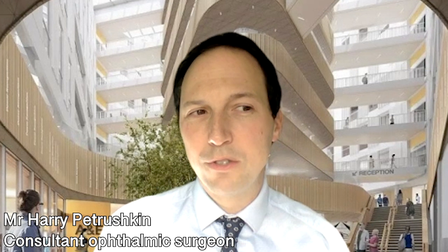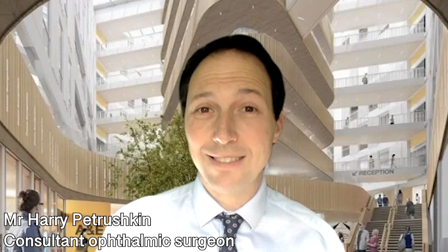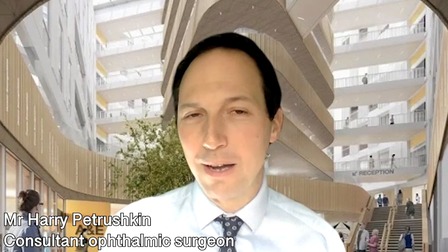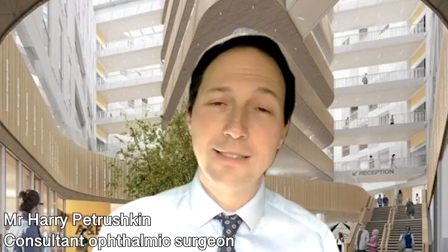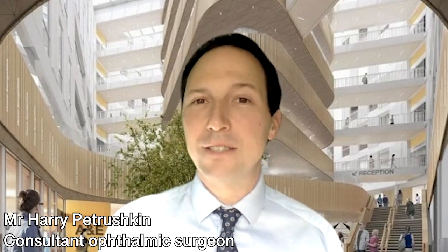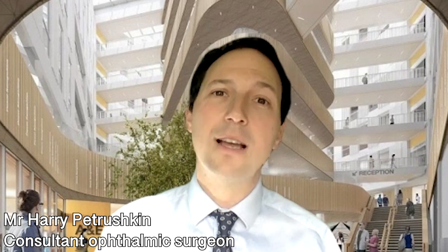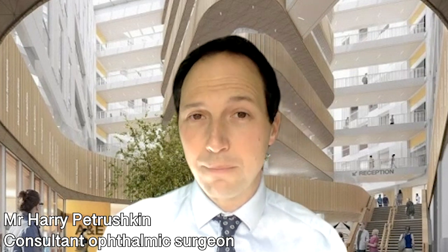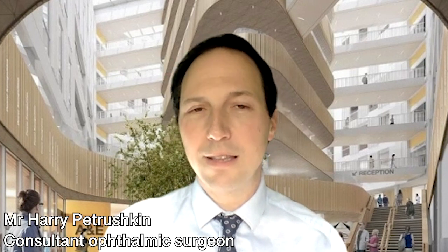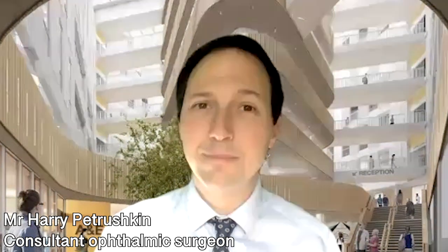And so you should really work quite hard before surgery to make sure that you have the right lens going inside the eye. However, sometimes lenses need to come out for a variety of reasons. Toric lenses might rotate, and so your astigmatism might be wrong. Multifocal lenses may not suit you in terms of the halos around lights, or very rarely some people have a very low-grade chronic infection inside the eye, which means that the lens needs to come out. So it is possible, but it's definitely not recommended.